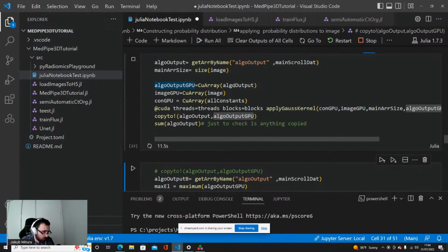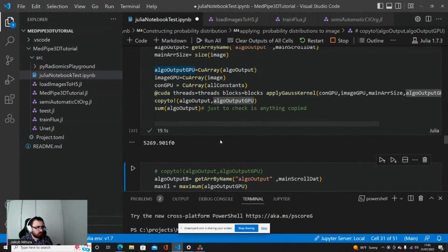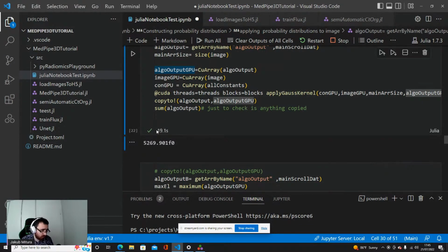So what is the important thing? Yes, we are doing a huge amount of work here, orders of magnitude harder than what we did when we were just finding the distributions. Then it took us 1 minute, and here the huge work that we needed took only 19 seconds on my GPU at least.